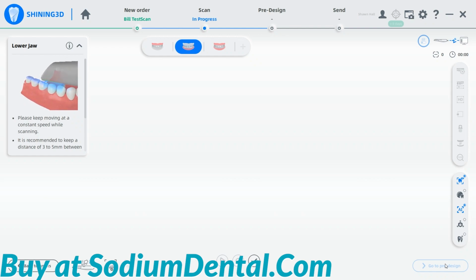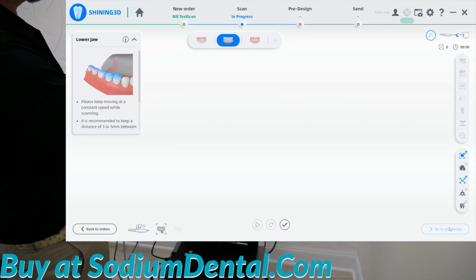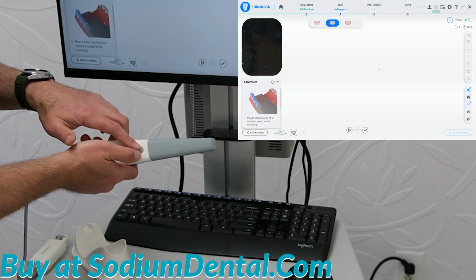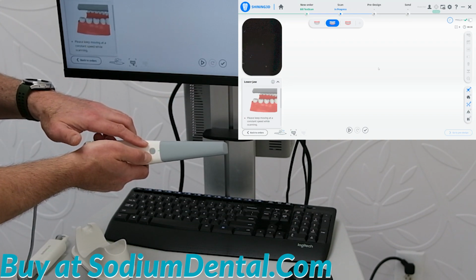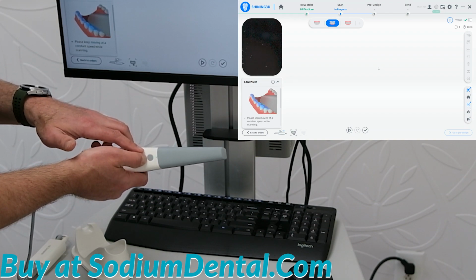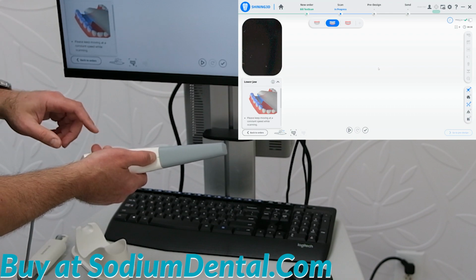You can see up here, it will give you advice on how to scan. Its recommendations are to scan by quadrant, starting with the occlusal surface, moving to the lingual, then to the buccal, and then moving to the next quadrant. You can see here it's selected to start with the lower arch. This button can be used to start the scan or pause the scan by pressing it once. I will press it once now.